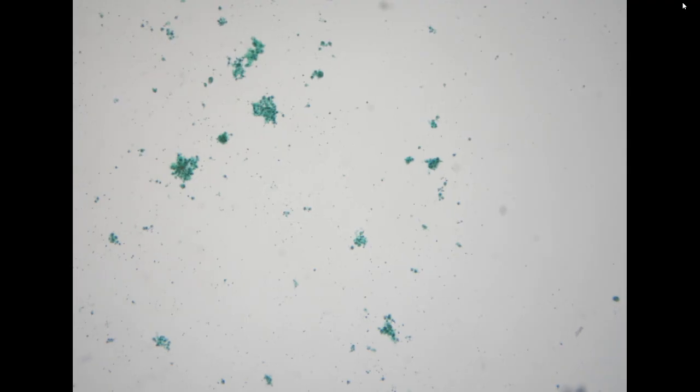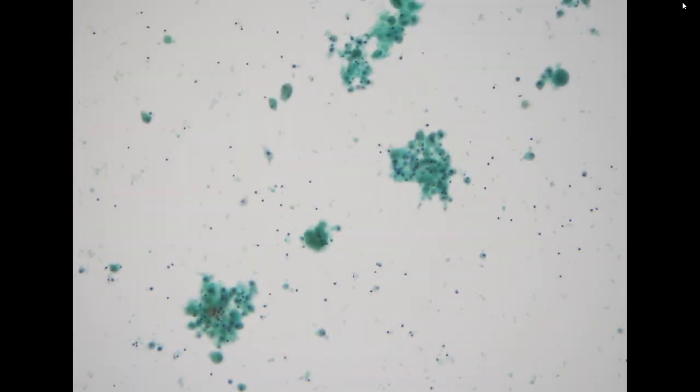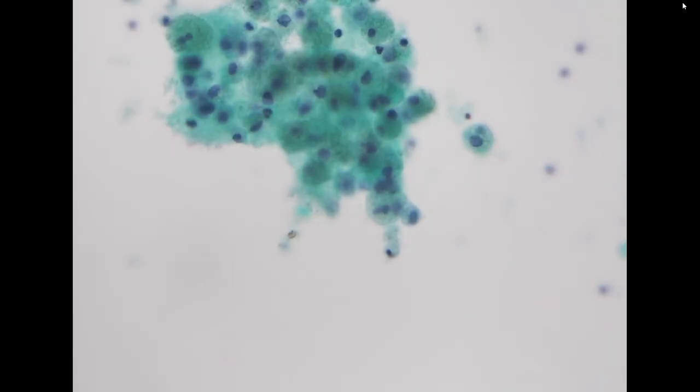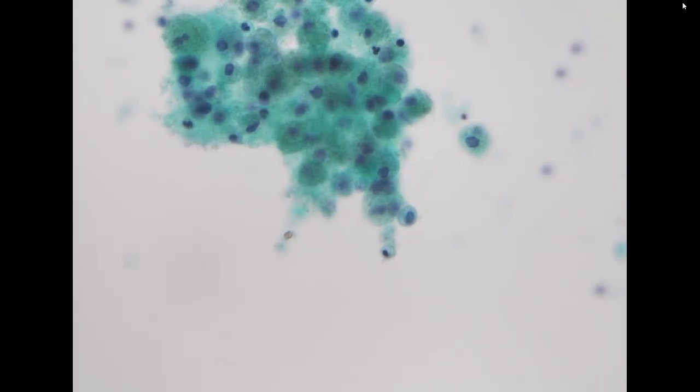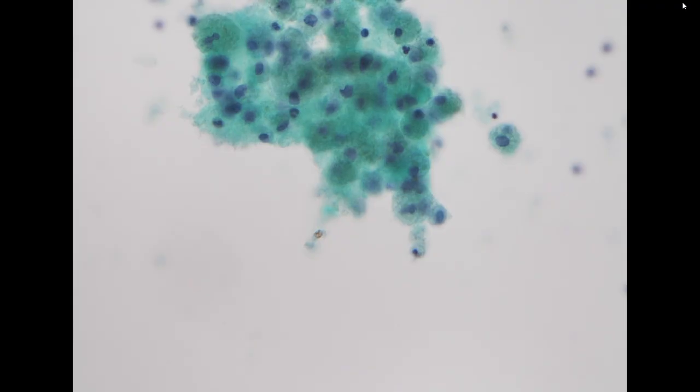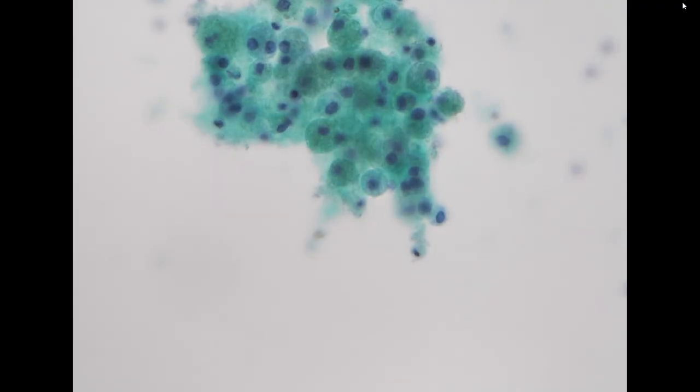So the next specimen is also from the parotid gland. In this specimen, you have a prominent cystic background, with most of the cells being histiocytes with some pigmentation inside. It could be hemosiderin, but it is not so coarse. So I'm not so sure if this is hemosiderin or not. But these are definitely cystic components with histiocytes.